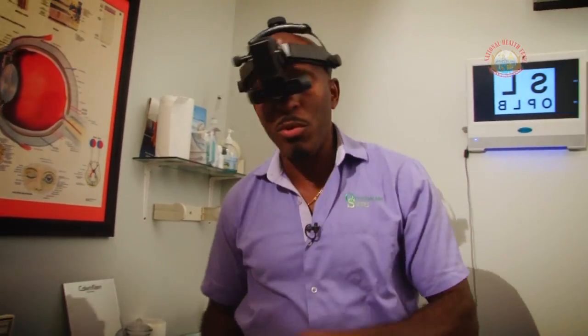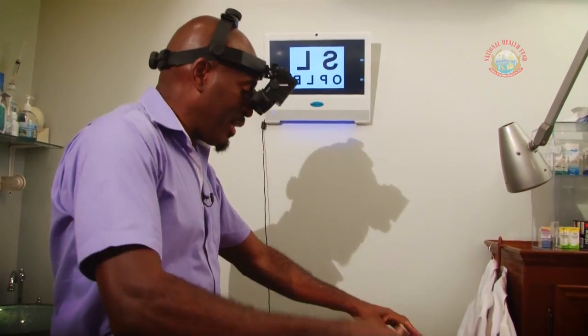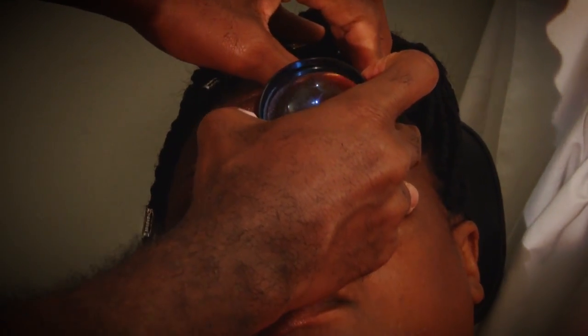You can also expect exposure to some bright lights, and an indirect ophthalmoscope is used to view the patient's retina. Look at me. So when this examination is complete, the doctor will have pretty much a clear idea of what is happening to the state of the diabetes, the effect of the diabetes on the eye, and the effect of the diabetes also on places like the brain and the kidneys, because what happens in the eye usually mirrors what is happening elsewhere in the body.